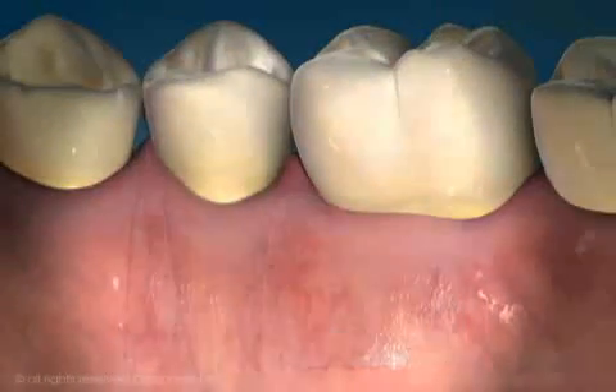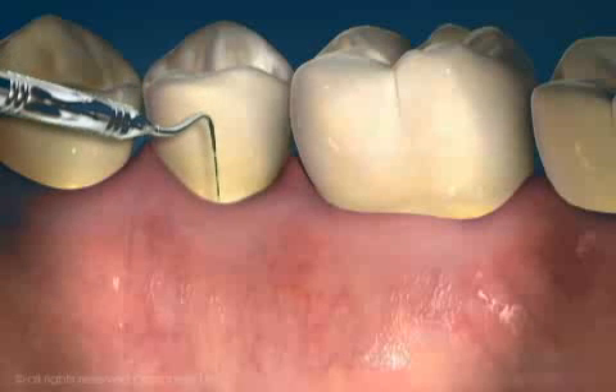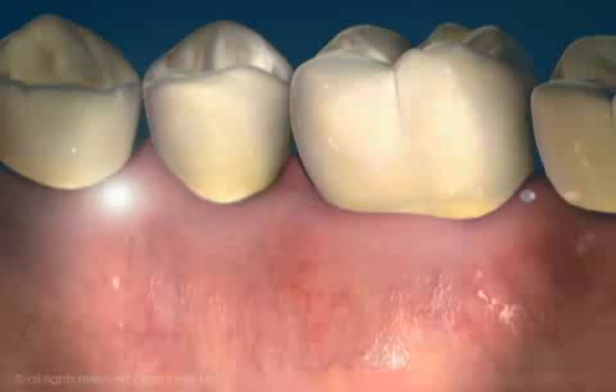In a periodontally healthy tooth, a probe placed at the junction of the tooth and gum will slip under the gum one to three millimeters or so. Healthy gum tissue is attached to the tooth.